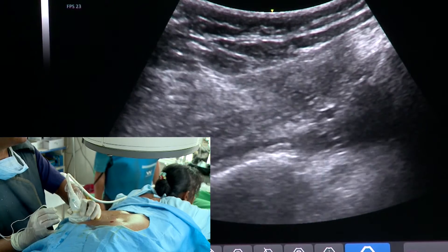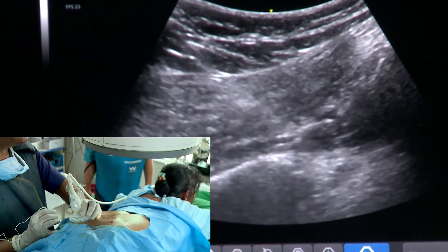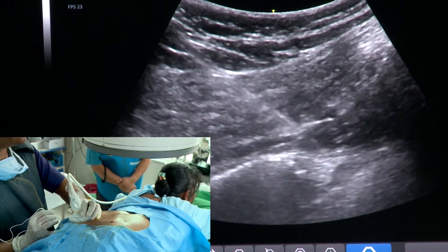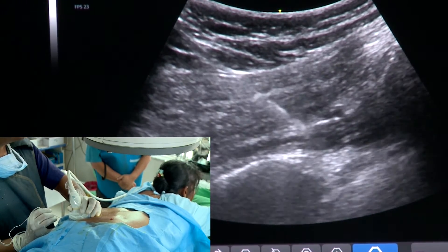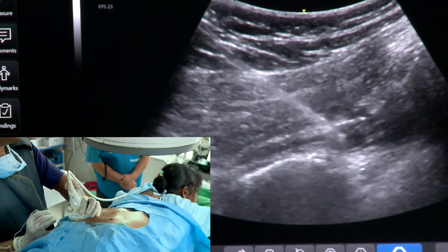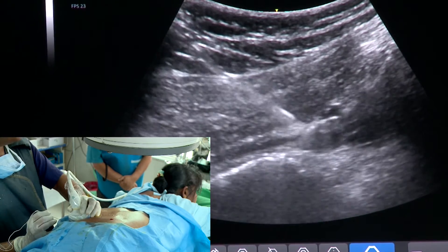The needle tip is in the piriformis now — it is here. I have gone through and through; I am now close to the target and my needle tip is exactly in the piriformis. So what we do normally within the piriformis is give a little bit of local anesthetic. The needle is nicely visible; I hope everybody can appreciate the needle within the substance of the piriformis.